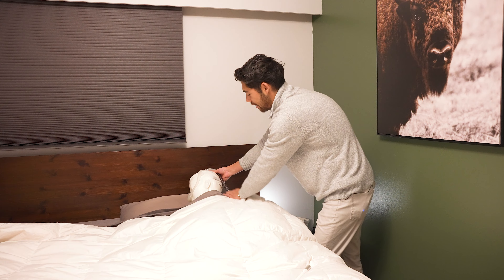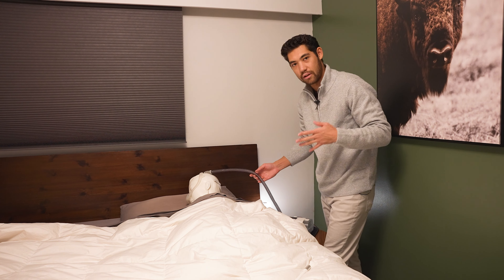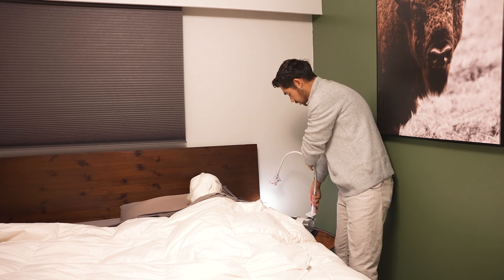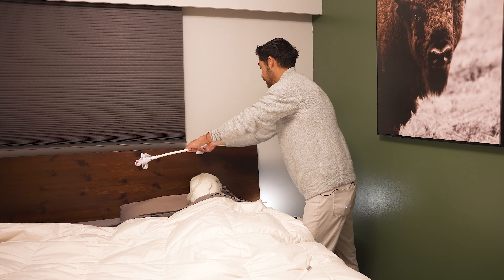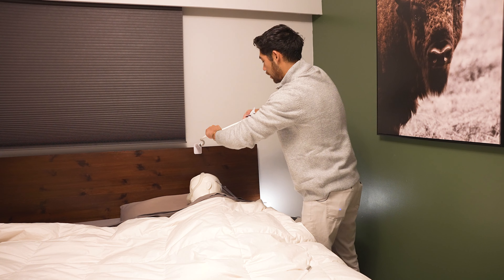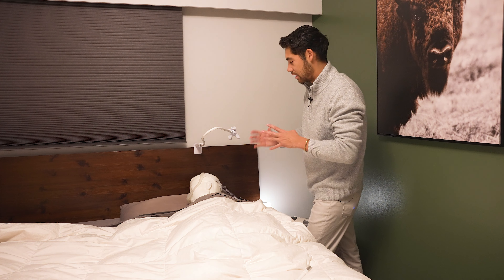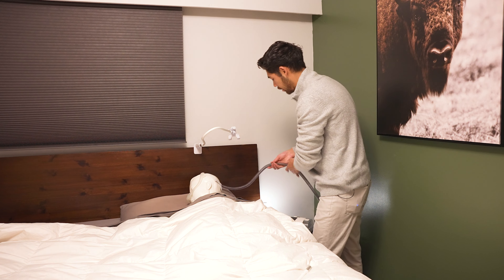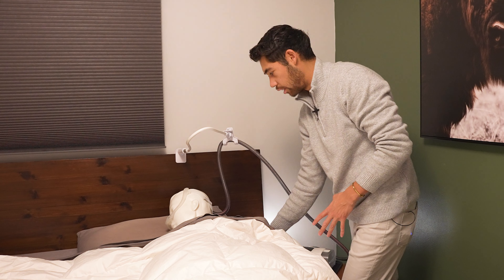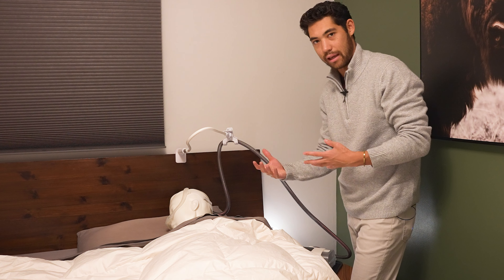If he still finds that the tube is interfering, we might want to elevate the tube higher than him, and we do that with tube hooks. This one has a bendy arm and a clamp at the bottom — we can put it on the nightstand or on the bed frame. We clamp it in place and bend the arm however required for his sleeping position. It'll depend on your bed height and the tube you're using, so you'll have to play around with it. All the weight that was dragging him down is now elevated, and he's not feeling the weight of this tube anymore.